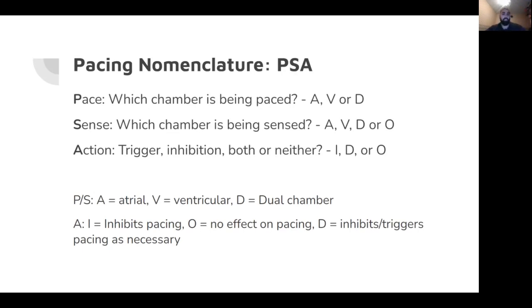If you're wondering why does it exist if it's so dangerous, it's because you can use it during the operation. So when you've put the pacing wires in and you're in the safe, secure environment of theatre and you're trying to get the heart pumping initially, you can just blast it with a VOO or a DOO mode. But other than that, it's not really useful.